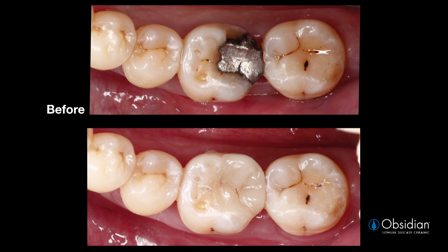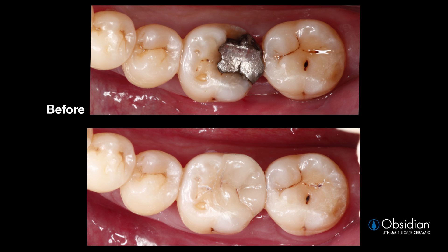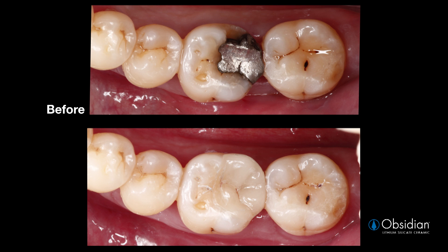That's it for this week's case of the week. We hope you enjoyed watching the onlay fabricated for this patient utilizing a digital workflow in a single appointment. For this onlay restoration, it took approximately an hour to complete after the preparation. Chairside CAD-CAM is an amazing technology that allows us as clinicians to provide extremely high-quality restorations for our patients within a single appointment. Thank you for your time. Back to you, Megan.